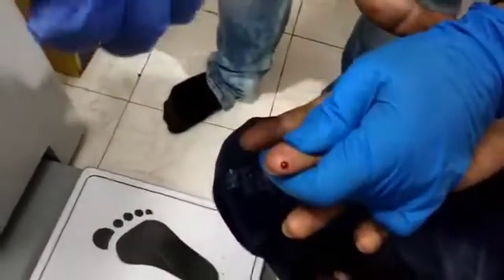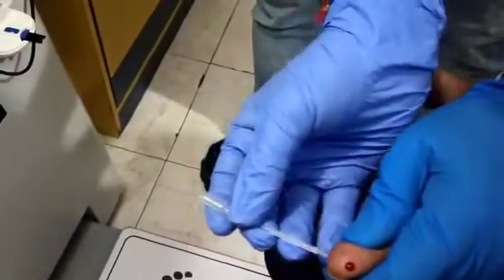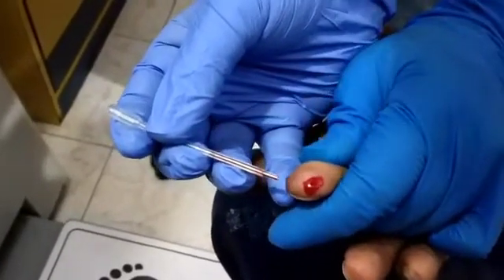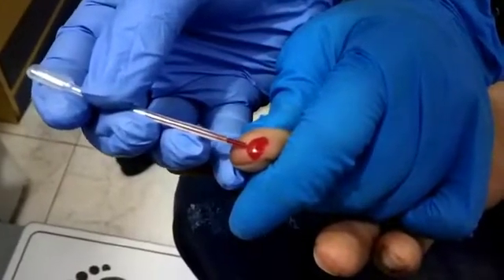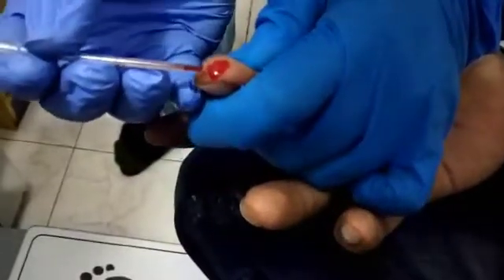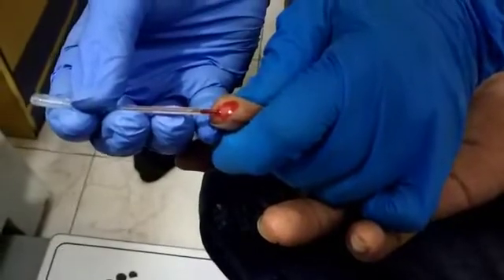Now this is the capillary where you have to fill until the black mark. Tilt the capillary first. Now it is filled up to the black mark.